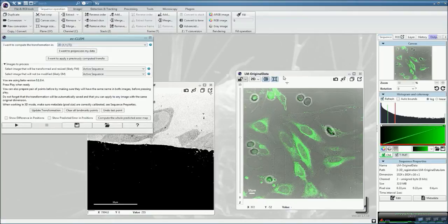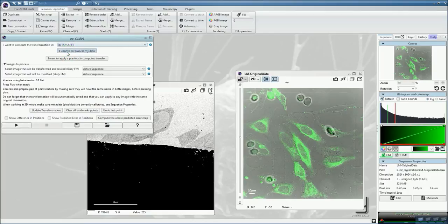What we want to get here is a final 3D projection to know exactly where the section is located. For that, we select here 3D fluorescence, 3D correlation.